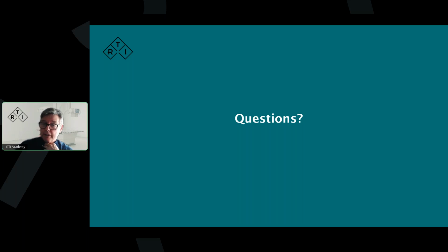The question here is, if we have the trigger level in normal mode, which is 0.6 mR per hour, does that mean that we will not be able to detect radiation which is less than 0.6 mR per hour? Well, that's the definition of a trigger level, I would say.